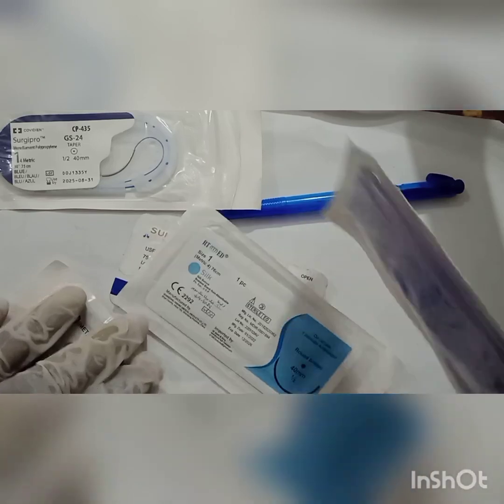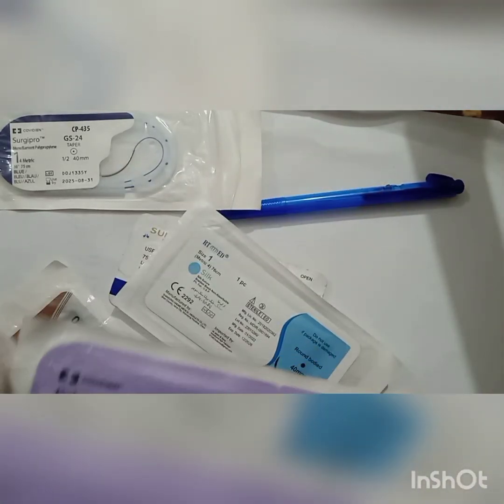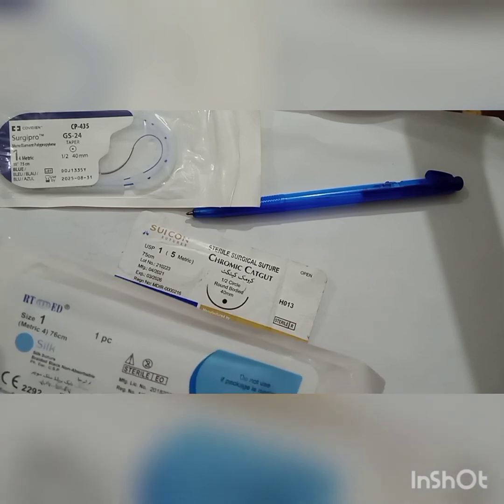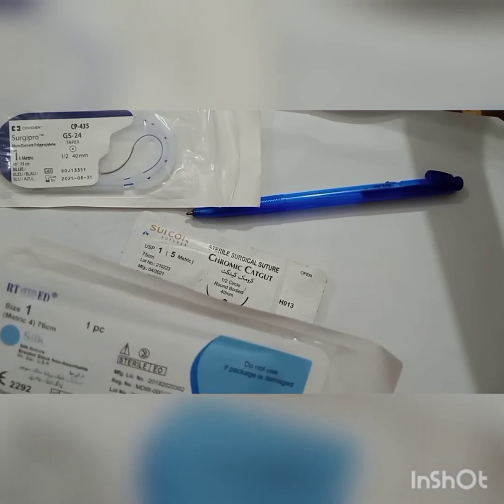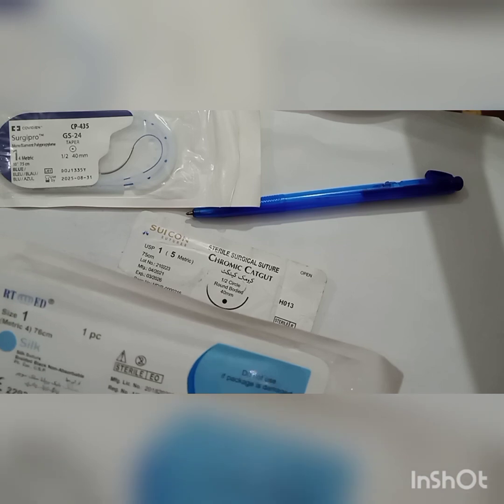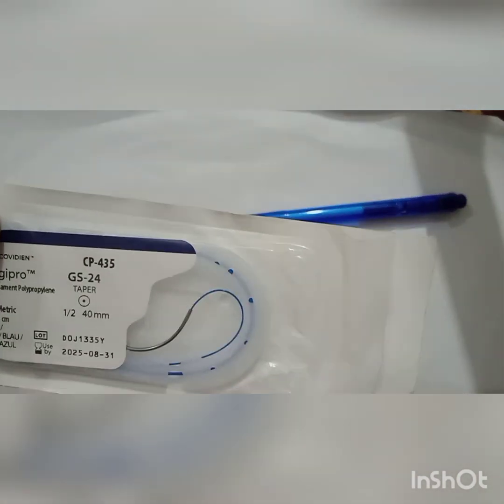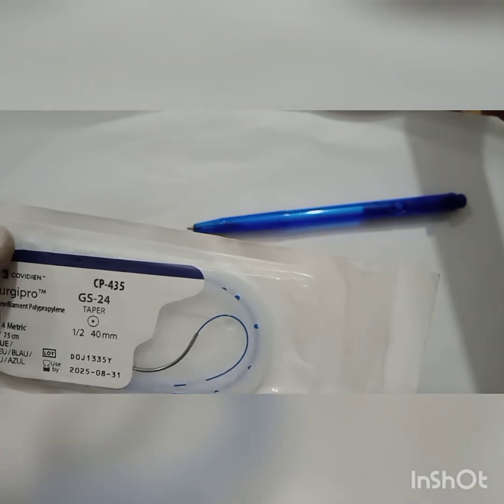Vicryl or polyglactin is a synthetic absorbable material. Silk is a natural non-absorbable material taken from the silkworm. It is a product of the silkworm. And polypropylene is a non-absorbable synthetic material.